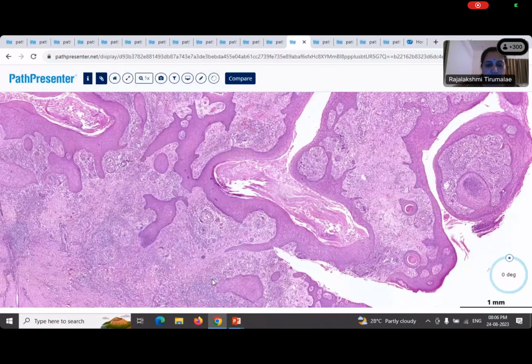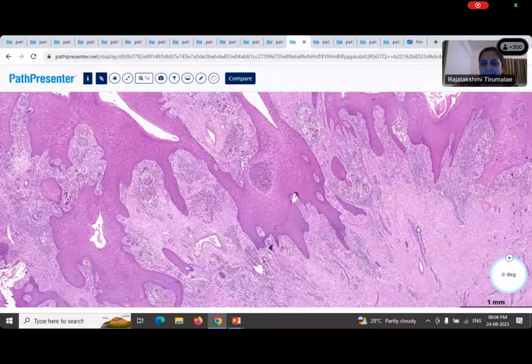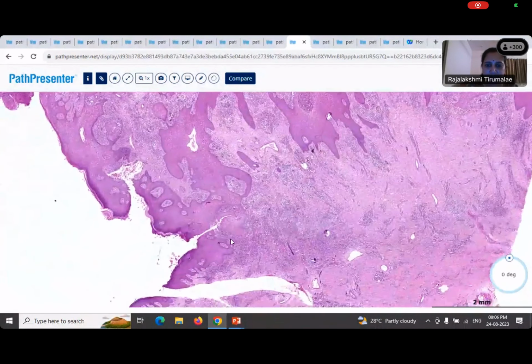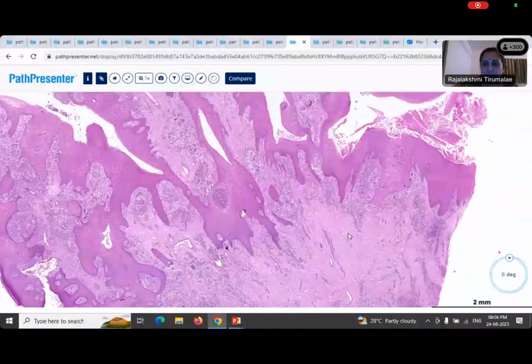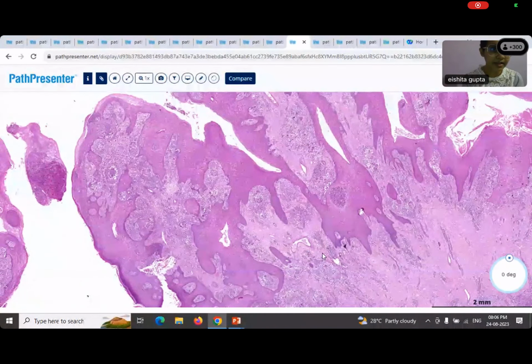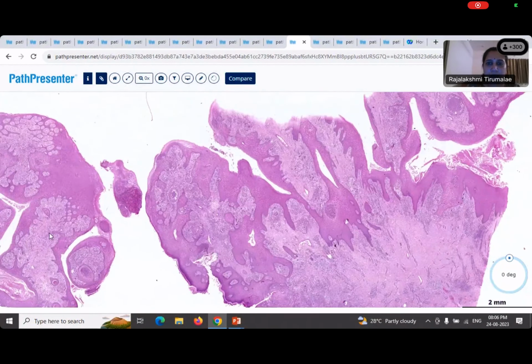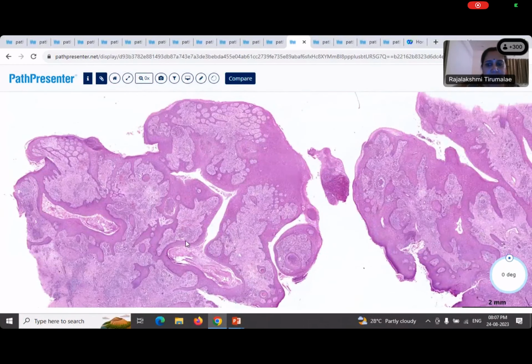I'm trying to delineate what you're seeing. Are they slightly larger than the perivascular infiltrates that you would see? Yes. So what is the term that you would like to use for that? Interstitial. So these are nodular, right? When you have a slightly denser infiltrate, you refer to it as a nodular infiltrate. So you're right, there's a nodular dermal infiltrate, and like you rightly said, what are the epidermal changes?